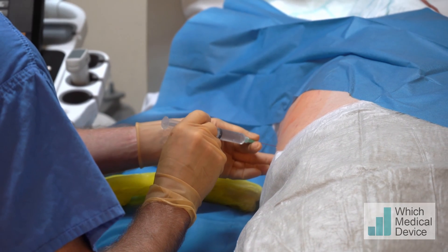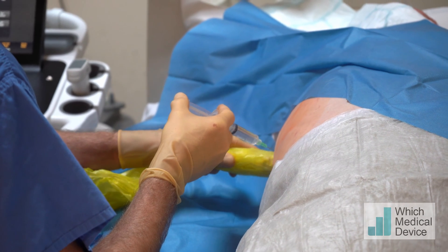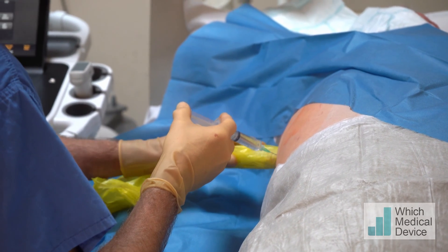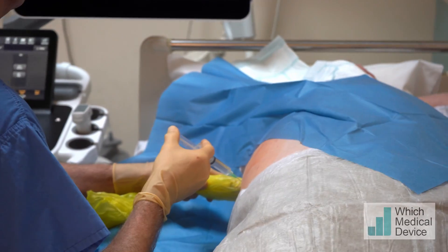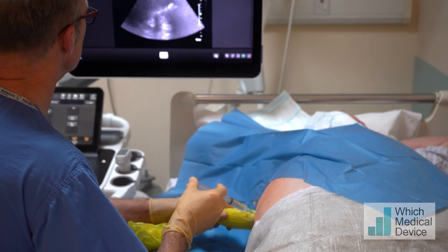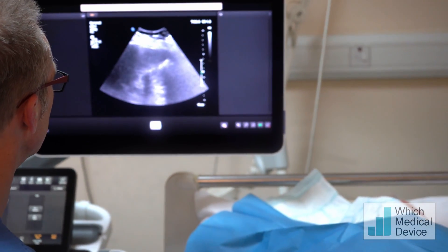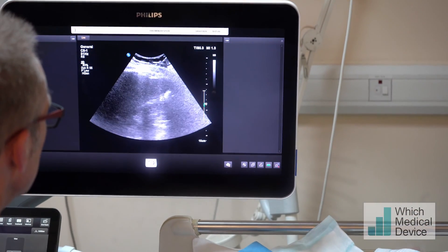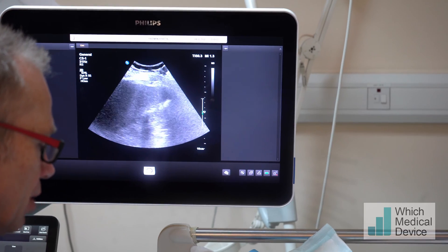Just going to pop that through the skin first with a bit of pushing. You might get the odd twinge from this, and I'll get you to stop breathing for a second in a moment. I'll say stop breathing — I don't need you to breathe in or out, I just want you to stop. You can just see the needle on the top of the screen there. This might sting a little bit — we're right down to capsule. Breathe away now. We're just injecting local as we come back.